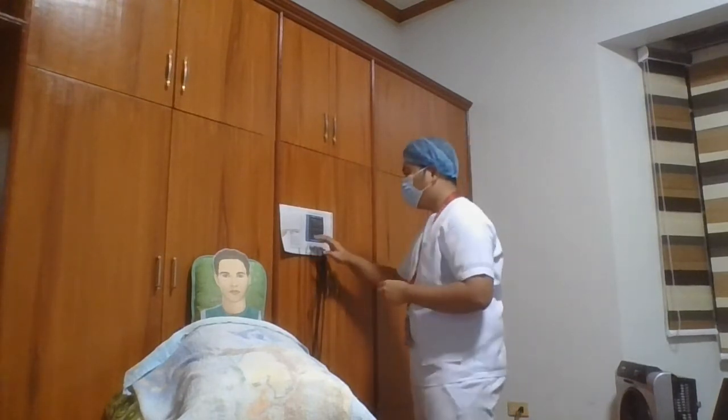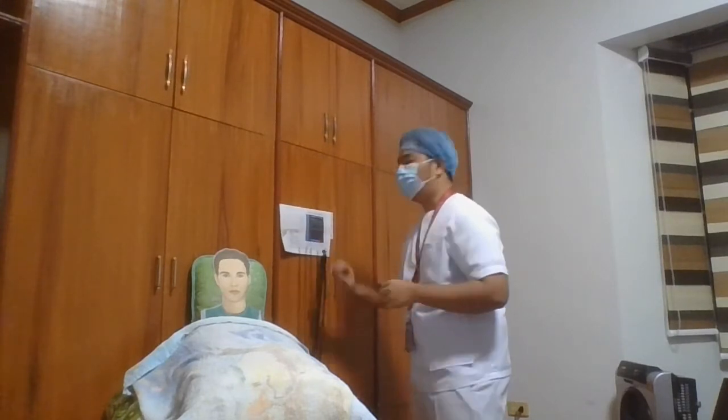And then afterwards, we're going to input the patient's identification information into the EKG machine — patient El Guapo. And then after that, we're going to assist the patient in removing the clothing or adjusting the patient gown to expose the chest, the arms, and then the lower legs.